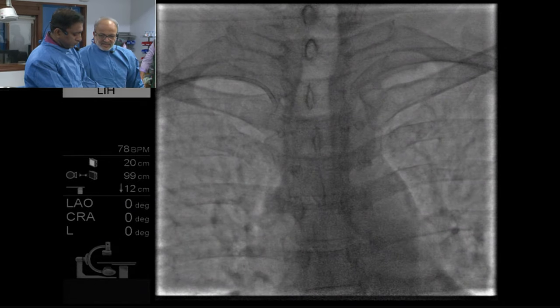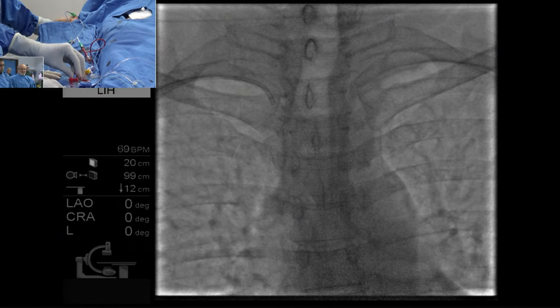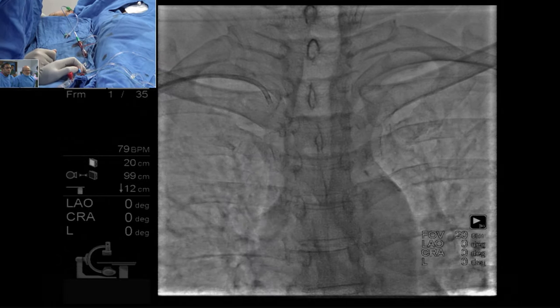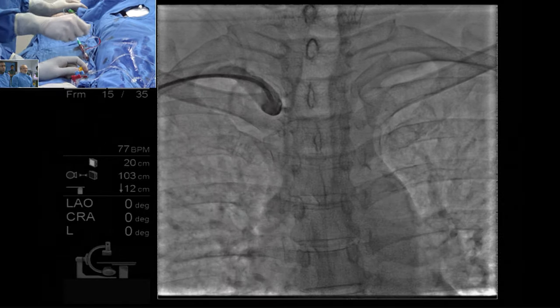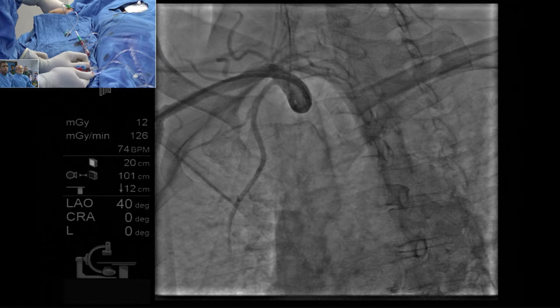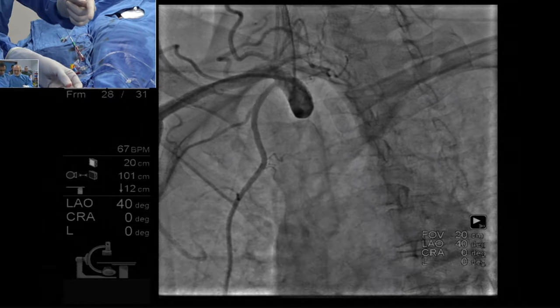You want to inject and see how the subclavian looks. This is an additional burden on a radialist, going through this type of complex radial and subclavian. Are we dealing with arterial lusoria or stenosis? It's a stenosis, not arterial lusoria, I can see. Change the view, go to LAO. It's a tight, maybe complex angle or tight lesion. Which is this wire?